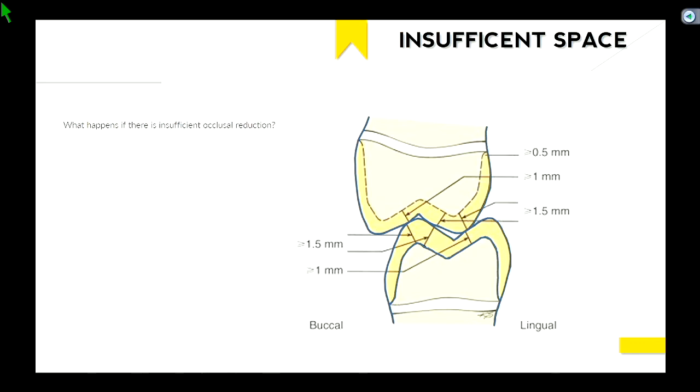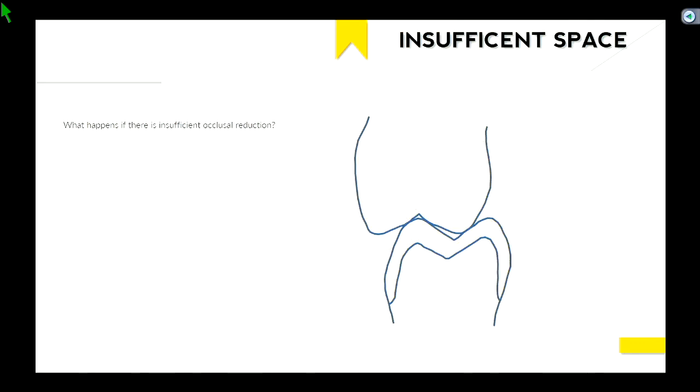Okay, so here we have outlined the tooth and the crown. So this is the ideal reduction. So let's say this crown was under-reduced, though. Well, one option is, once you have it mounted, so the blue outline means that this is in stone. So this is what the lab technician sees, okay? So they see, oh, insufficient space for a PFM. Crap. What do I do?